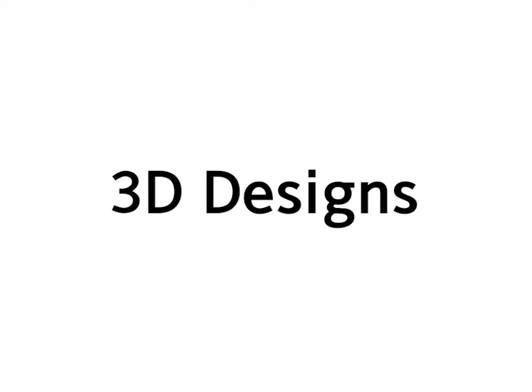Now let's move on to the 3D design. After acquisition with a scanner, 3D image files can be imported to a design software that would have different tools for manipulating, editing, and designing the 3D model or the final future restorations. It is important to note that this software could be proprietary or open source and frequently includes a suite of different work models.